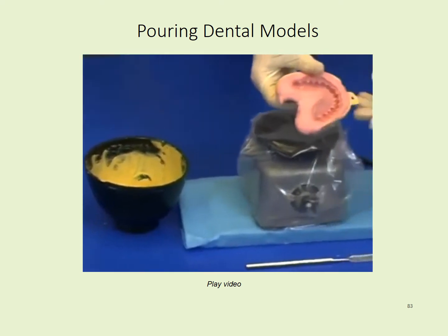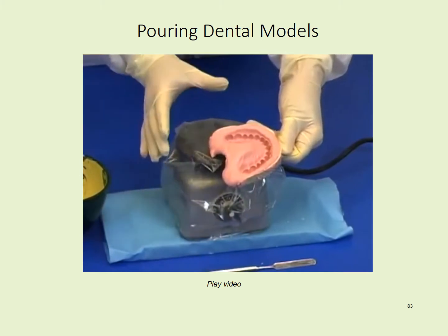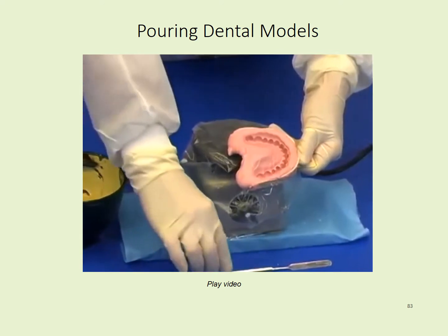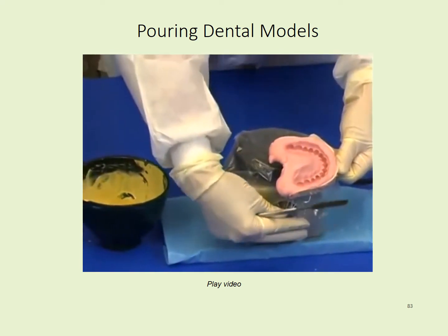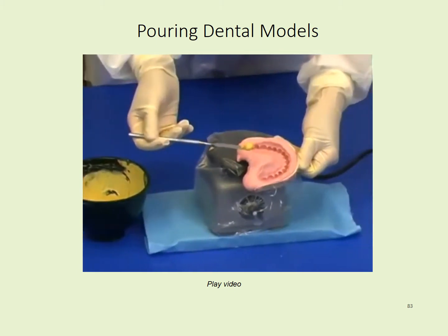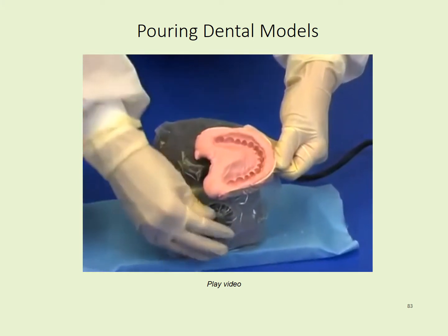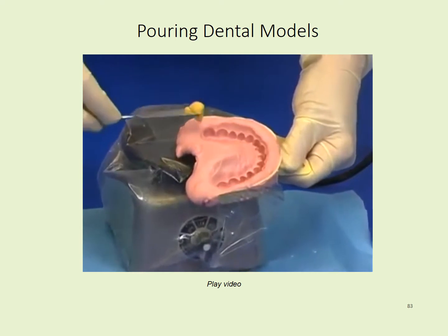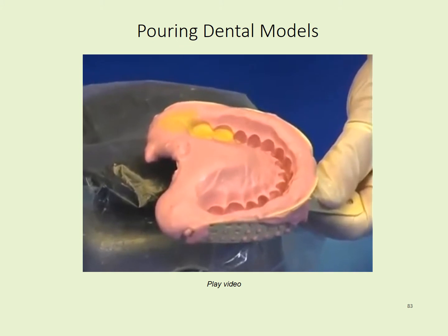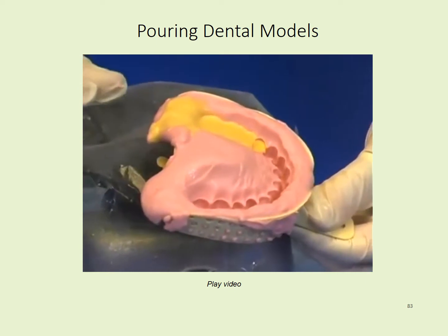Holding the handle of the impression tray, place the tray onto the surface of the vibrator. Angle the tray with one posterior edge touching the vibrator. Pick up a pea-sized increment of stone on the end of a small spatula. Allow the stone to flow into the tooth indentations. Tilt the impression as needed to aid the speed of the flow.